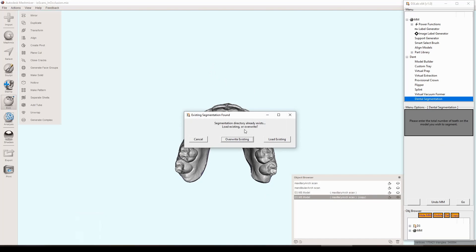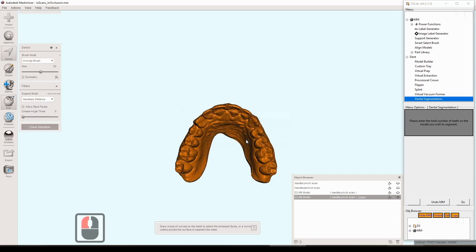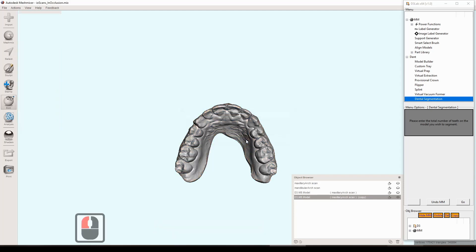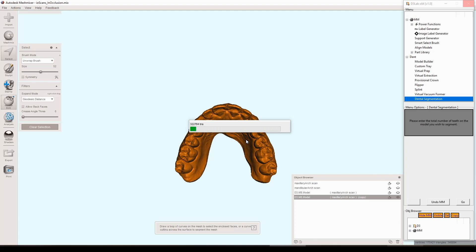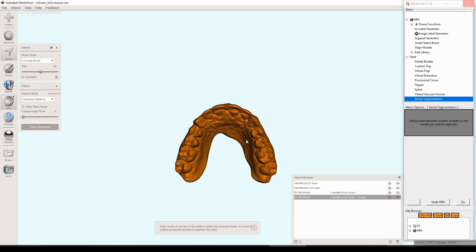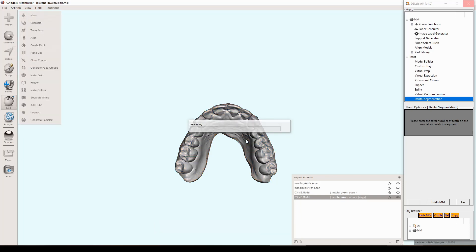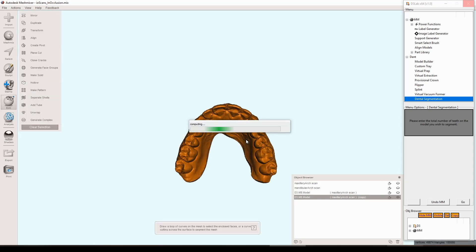This pop-up comes up and says there is already a segmentation, would you like to load it or overwrite what's already there. That's a nice feature if you've already done this before because this actually takes quite some time. If you've already done this on a model and it recognizes it based on the name, then you have the ability to just load that segmentation which cuts out a vast majority of the time.